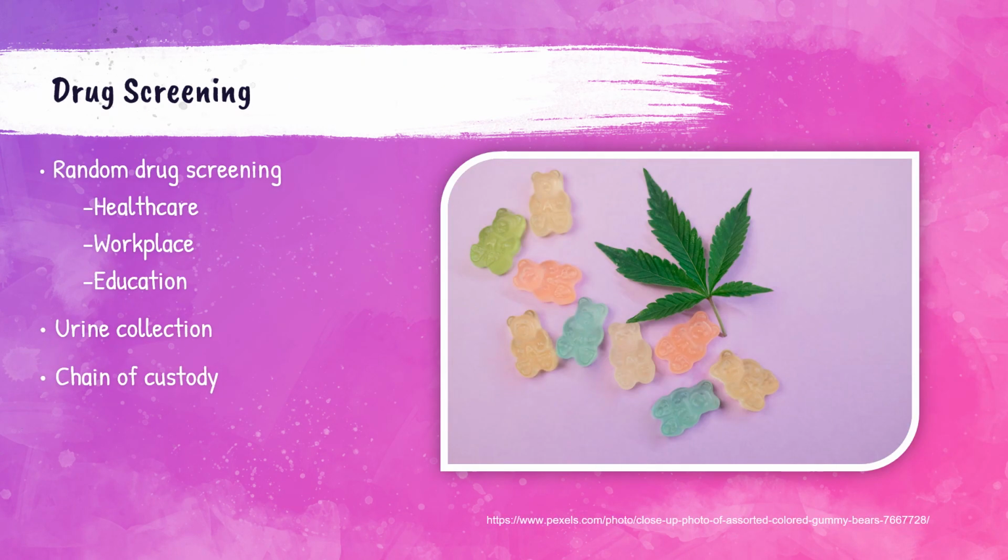Drug screening can be performed for healthcare, employment, and educational reasons. Samples require a chain of custody, and a urine is usually the primary sample for drug screening, although blood can be used.